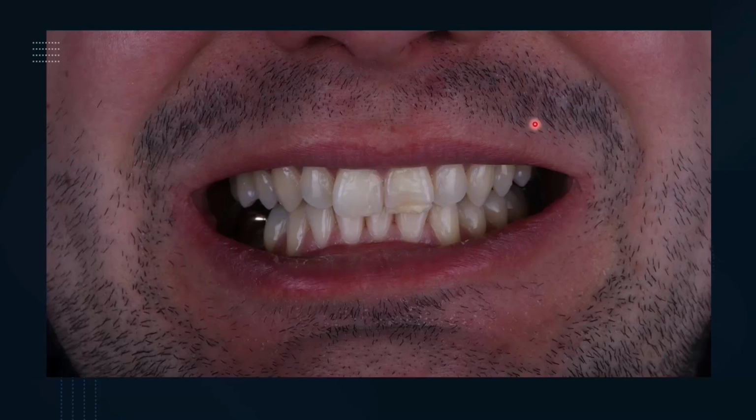Buccal corridors in this case, the simple descriptor is that they are quite dark on the right hand side. Otherwise, I would describe them as reasonably well developed.